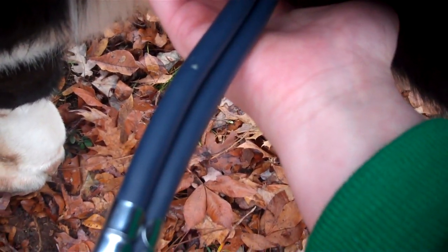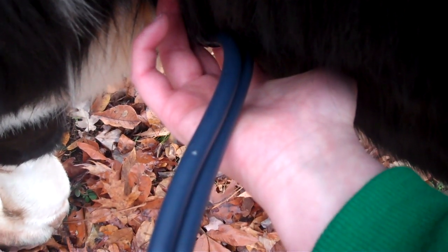Alright, so hopefully, hi Charlotte! Oh, I don't drop the stethoscope. So you just want to listen to a normal rate and rhythm on a cow. Most cows are between 60 to 80 beats per minute. Okay, she's at right about 68 to 72 beats, so that's totally normal.